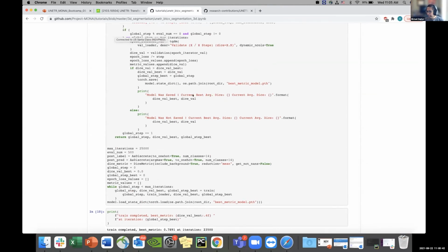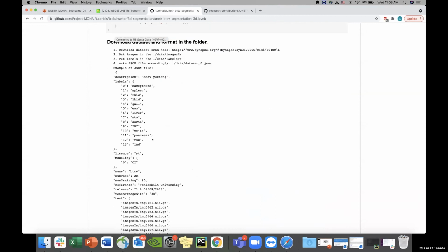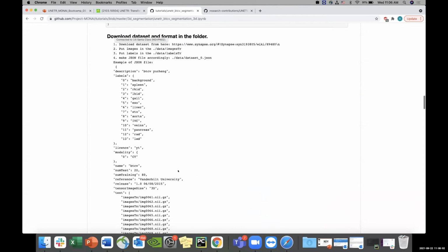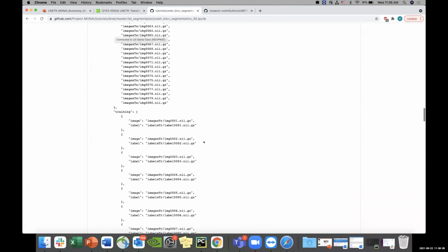And then one last question that I see here would be, how large is the data set we need to train for this UNETR, for that transformer model? What sort of data set? Another great question. So for the BTCV data set, I think we also have some explanation of what we used, right? So this BTCV data set is actually a very small data set. So 24 samples or so.